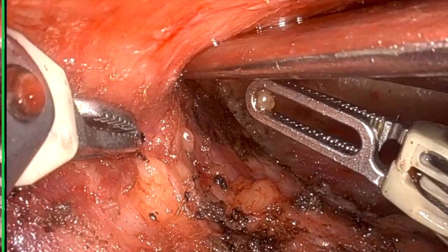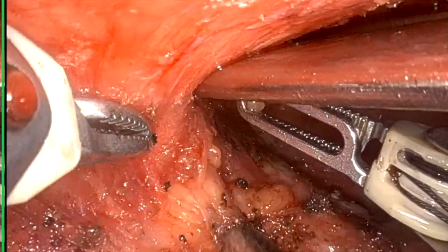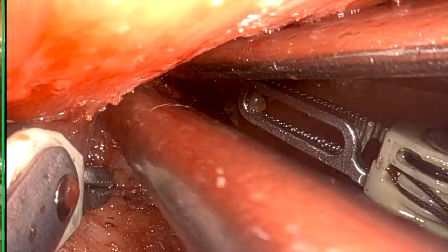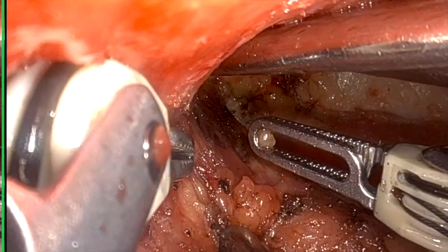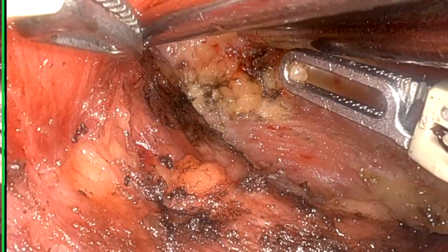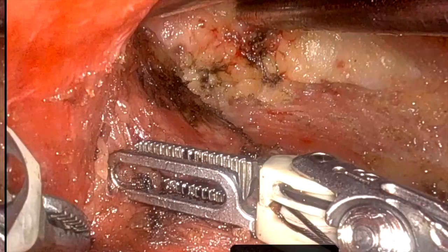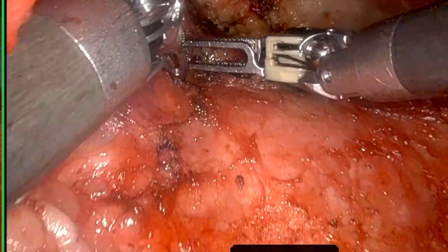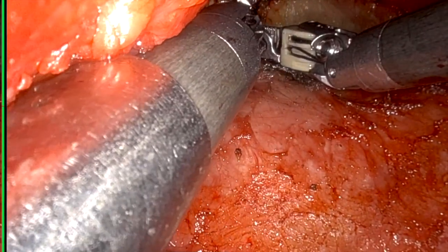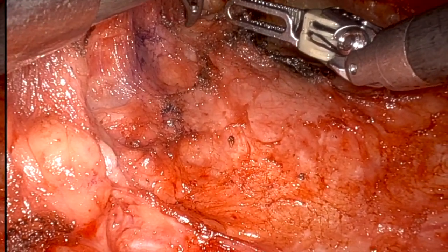Right now my assistant is telling me this is the lower border of the mandible. Second thing, it rarely goes below the angle of mandible. And the third one, Hayes-Martin's maneuver of preservation of the marginal mandibular nerve is not advisable here as we are dealing with malignancy, and we don't want to leave any tissue behind at the 1B area. We will be looking for the marginal mandibular nerve just above the lower end of the mandible, below one or two layers.